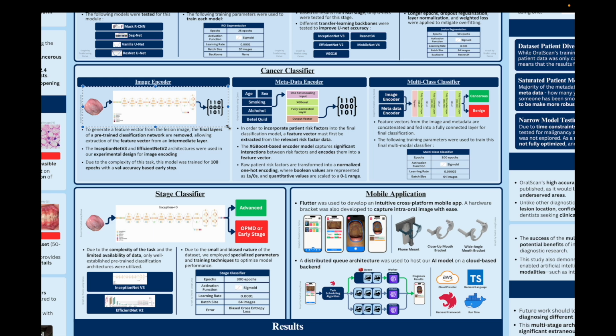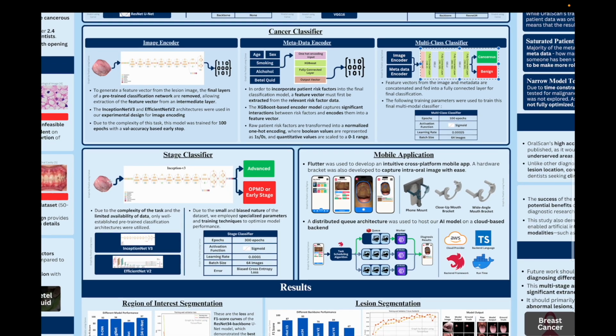Then it combines it with a feature vector that is derived from a list of patient risk factors such as their age, tobacco usage, and drinking habits. Both of these vectors are fed into a fully connected classifier to determine whether the lesion is cancerous or benign. If cancerous, the lesion is passed to a second fine-tuned Inception v3 model that distinguishes the cancer between early and late stage.